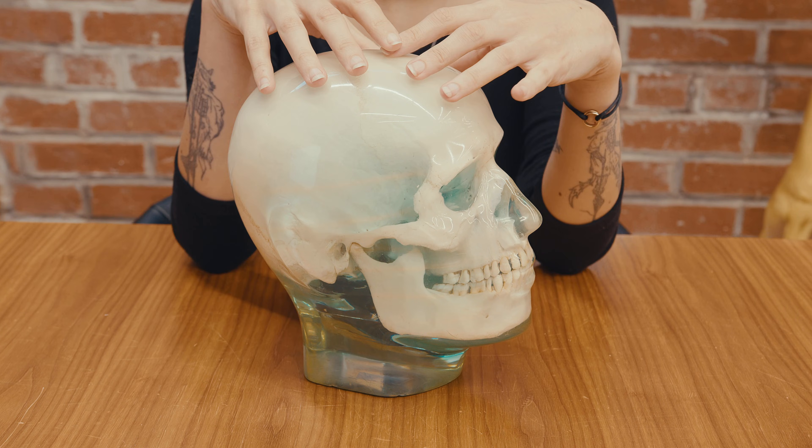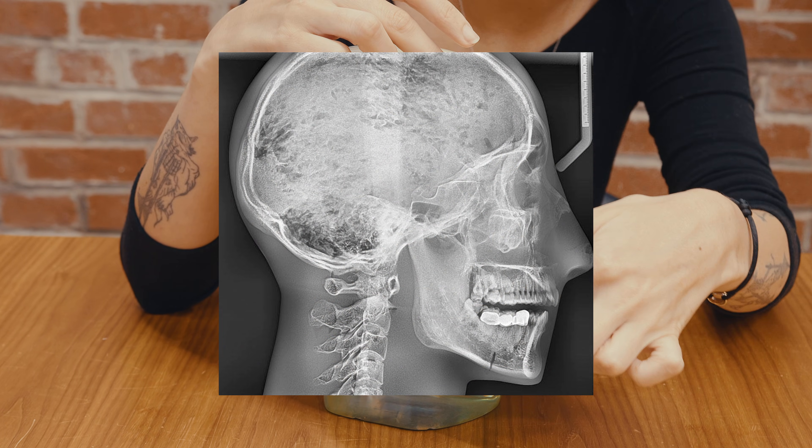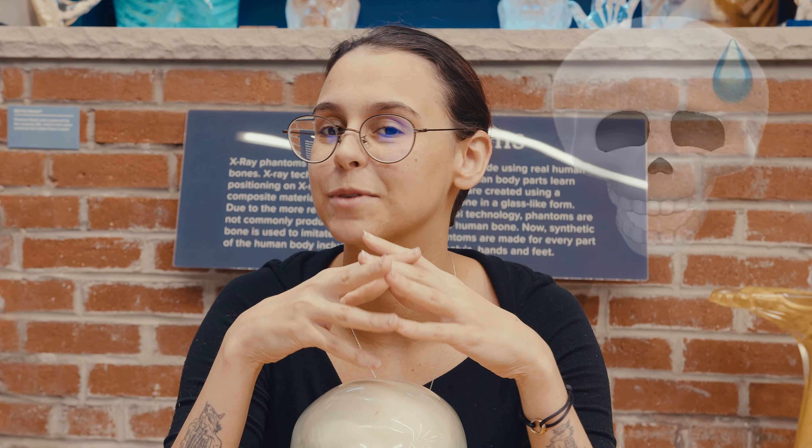They're also used to teach imaging positionings to new X-ray techs. Because they're completely see-through, you can see every single bone inside, and if there's a specific bone or area of the bone that you need to take an image of, you would know exactly where to target the X-ray. These became really important in the advancements of radiographic imaging, such as CT and MRI machines. They were all tested on phantoms first, before they moved on to humans, because luckily, we do not test on humans anymore.